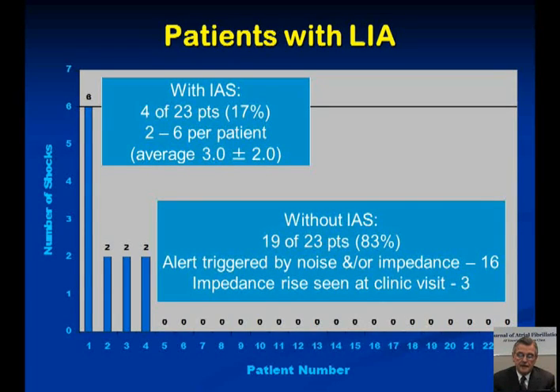19 of our patients did not receive inappropriate shocks. The alert was triggered by noise and/or an impedance change in 16. And an impedance rise was found during a clinic visit in 3 patients.